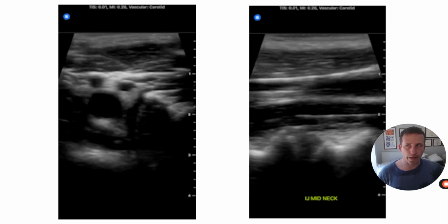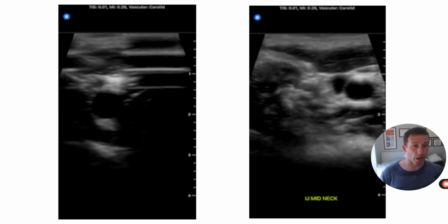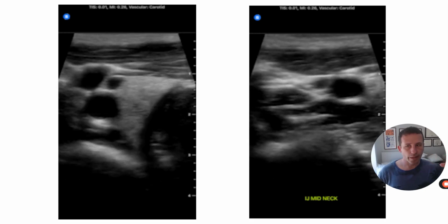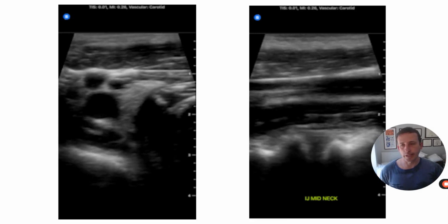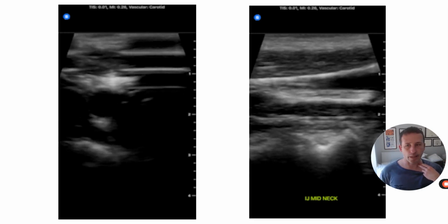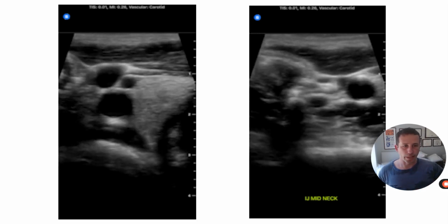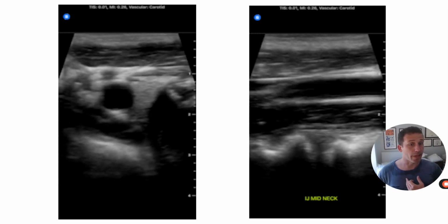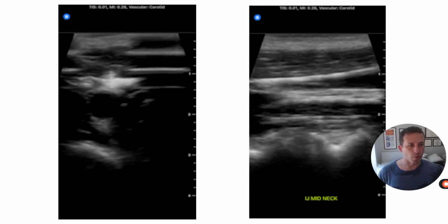And that's it. So practice finding IVC views, look at it in short and long axis. You can try some M-mode measurements to get a thickness and also a variability with respiration. And then additionally try to find each other's jugular venous pulses and the height of that jugular venous column to assess right atrial pressure. And you can even try mixing in some parasternal long views and adding the depth of that right coronary cusp or the non-coronary cusp to get a more formal assessment.